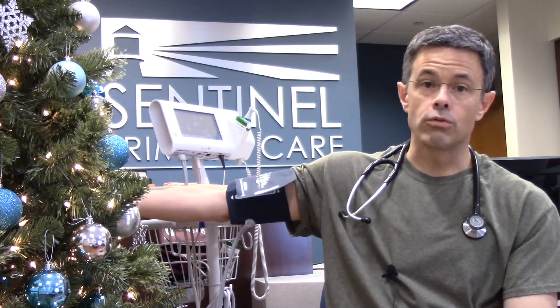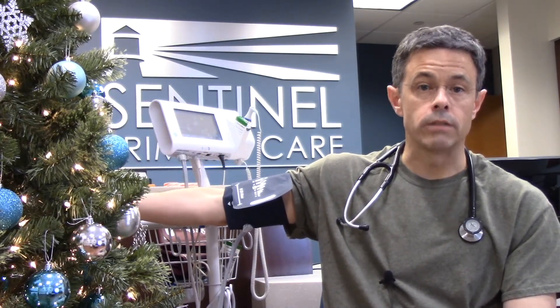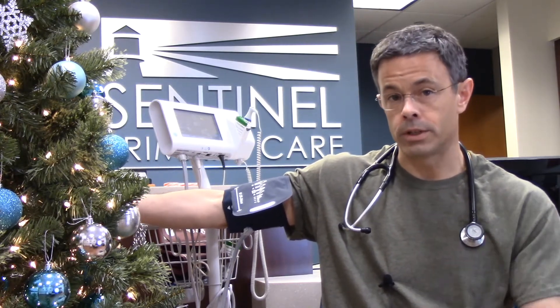Number two: the equipment you use. First, make sure you use the correct size cuff, because if you have the wrong size you'll get consistently inaccurate numbers — refer to the instructions on your particular machine for that. When putting the cuff on, it is preferable to place it against bare skin rather than over your sleeve, as a sleeve can cause inaccuracy.